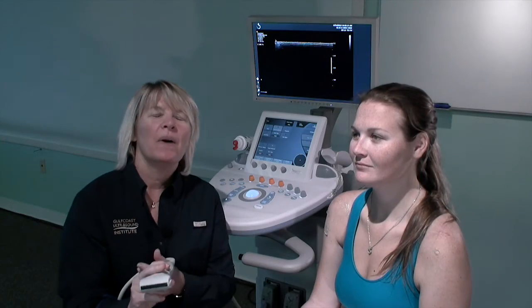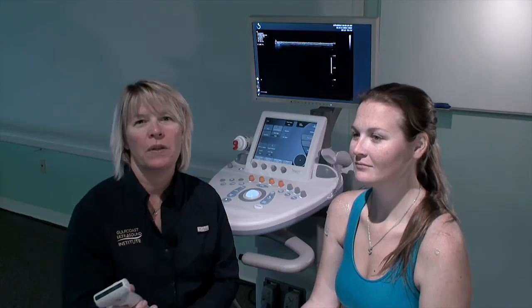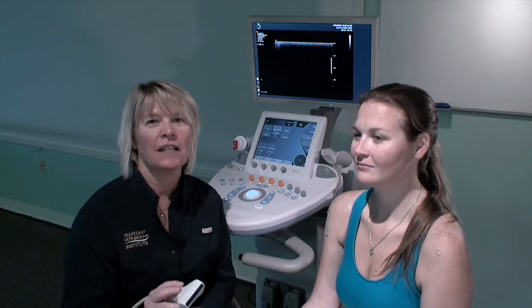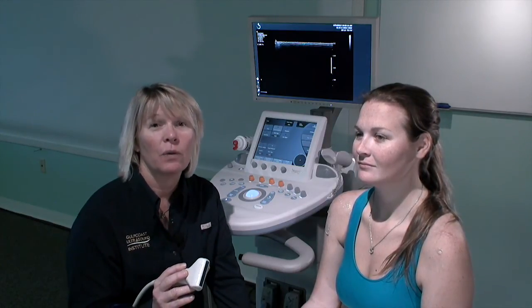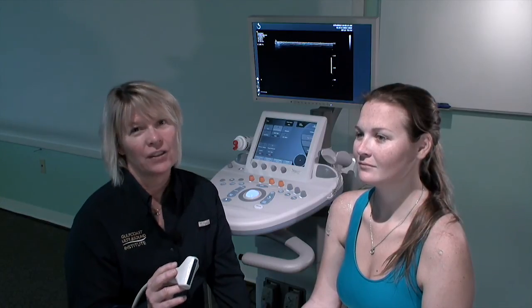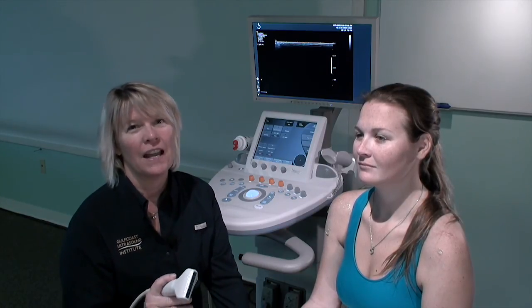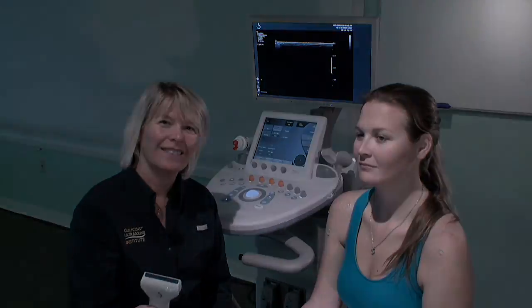By practicing these small transducer manipulations, one will be able to fine-tune your scanning techniques and be able to correct for the artifact anisotropy. That's your scanning tip for today — now you give it a try.